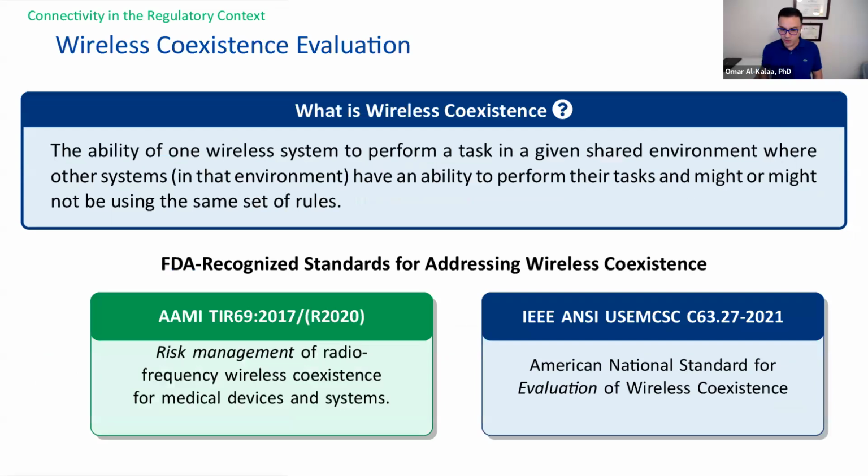So I mentioned evaluation a few times, and that is a practical recognition of how common Wi-Fi and Bluetooth and other similar technologies are in medical devices. And again, those technologies are excellent. They're available. They're not very expensive to implement. And they're ubiquitous. Everybody has Wi-Fi and Bluetooth in their smartphone. So it makes a lot of sense to use them. But those technologies also operate in unlicensed spectrum, and the issue of wireless coexistence is central to that type of spectrum access.